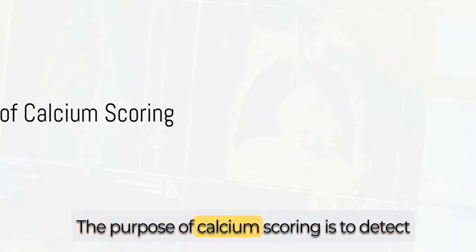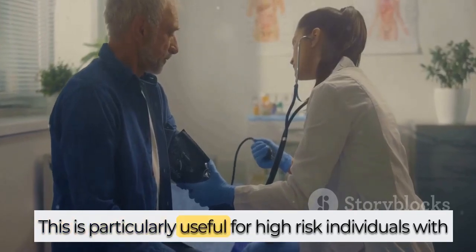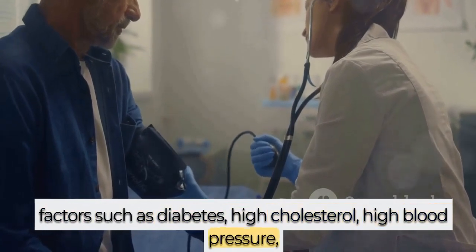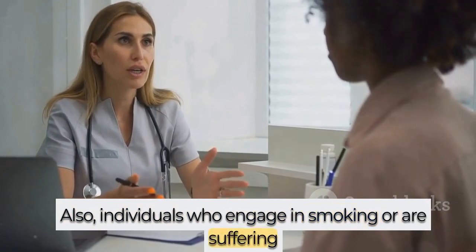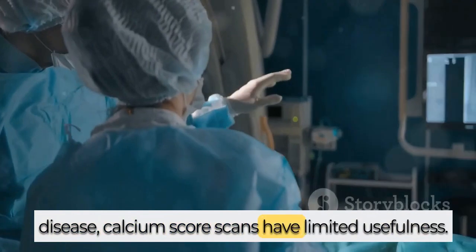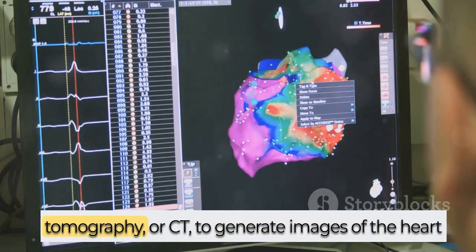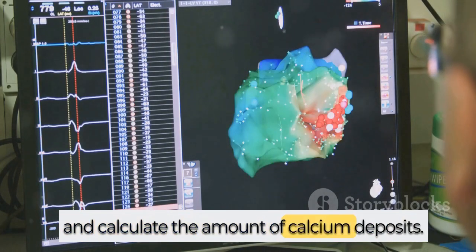The purpose of calcium scoring is to detect these plaques in individuals who show no symptoms. This is particularly useful for high-risk individuals with factors such as diabetes, high cholesterol, high blood pressure, or a family history of heart attacks. Also, individuals who engage in smoking or are suffering from obesity fall into this high-risk category. However, it should be noted that for those who have already been diagnosed with coronary artery disease, calcium score scans have limited usefulness. These scans utilize a high-tech tool called computed tomography, or CT, to generate images of the heart and calculate the amount of calcium deposits.